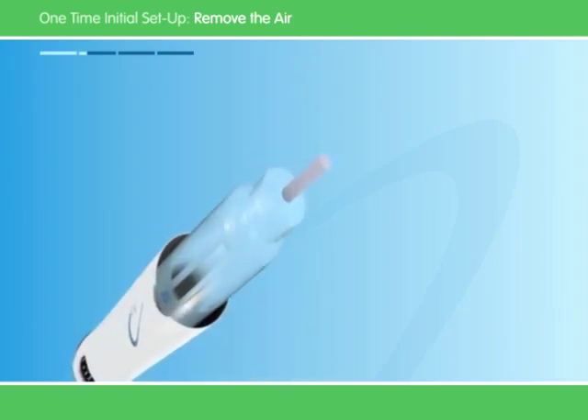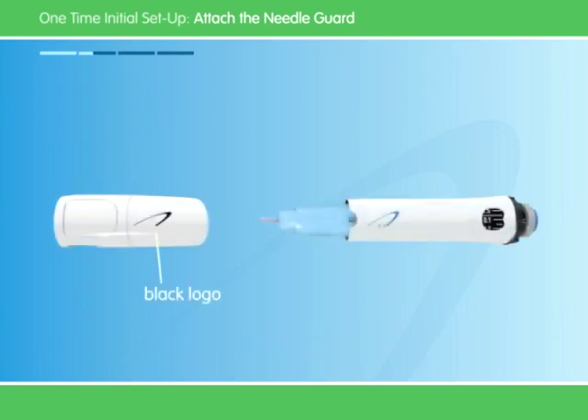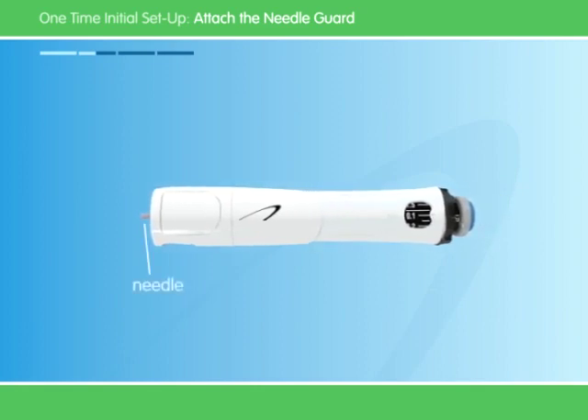Don't worry if a little medicine leaks from the top — this is okay. After you've removed the air, you can attach the needle guard to hide the needle from sight. Take the black cap off the needle guard. If the needle shield comes out, push it back in. Next, align the black logo on the needle guard with the blue logo on the pen. Once aligned, push the needle guard onto the pen until it clicks into place. Be careful of the capped needle that will still be poking through at the bottom.